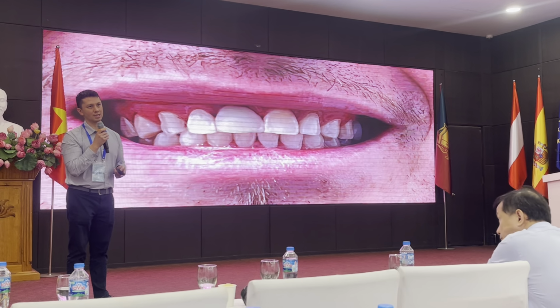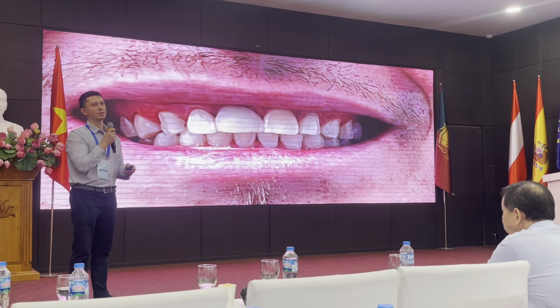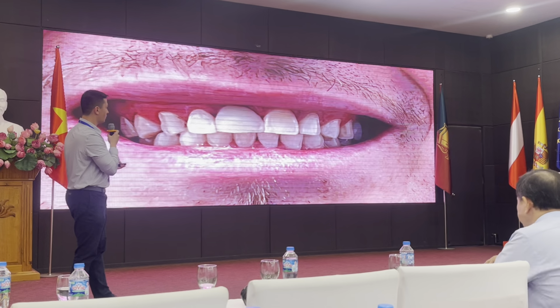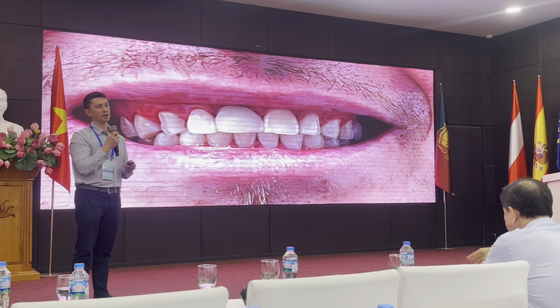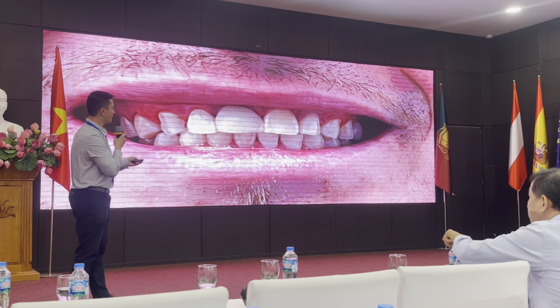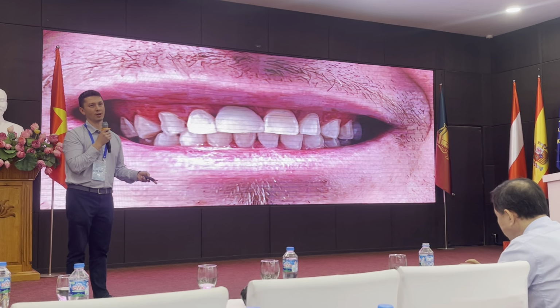I can't guarantee. I can't prevent occlusal forces hitting this provisional crown, but I can do the best that I can so that whenever he's biting down with no food, there's no contact here, and also remind the patient that this is not for chewing, this is just for looks, because any excessive forces on that provisional tooth will increase the chances that the implant could fail.